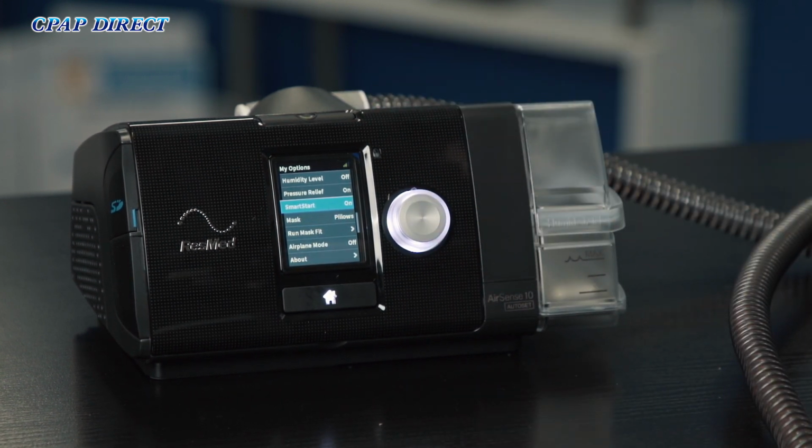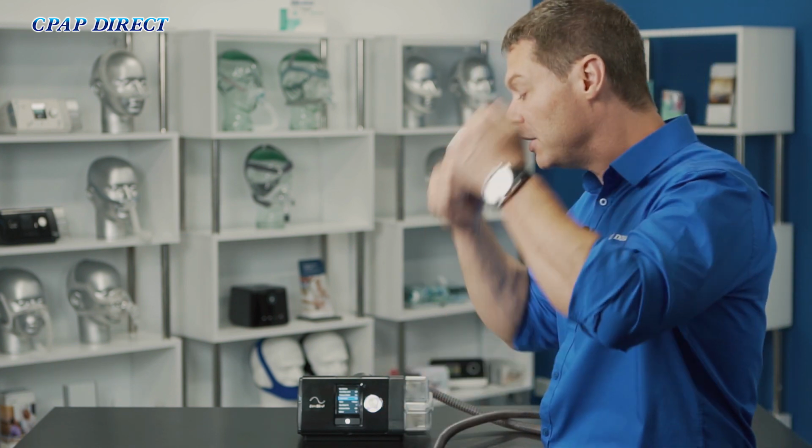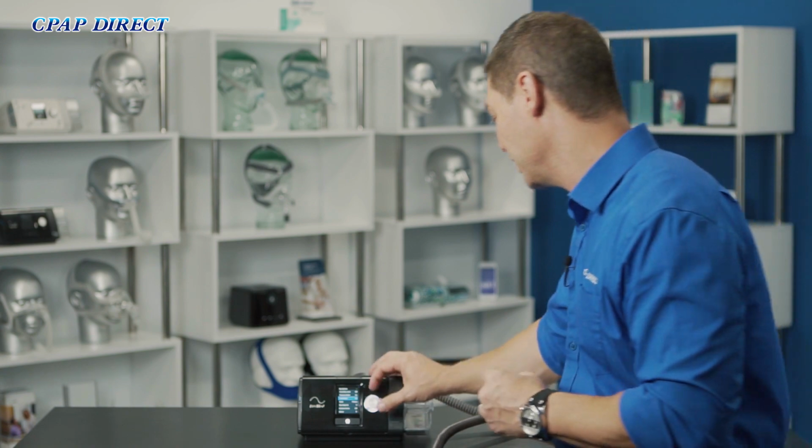As we move up, Smart Start is an option where the machine will automatically turn itself on when you start breathing into it, and subsequently will also turn itself off when you stop breathing into it, when you take the mask off. It'll take about 9 or 10 seconds to turn itself off if you've got Smart Start turned on and you take the mask off. So just bear in mind if you've got a partner lying next to you that they will hear air blowing everywhere when you take the mask off initially.